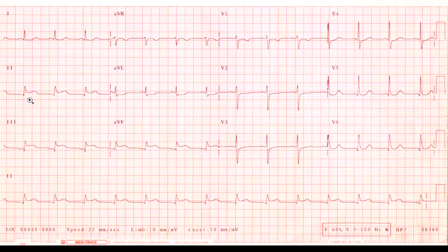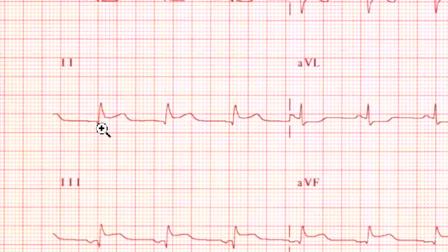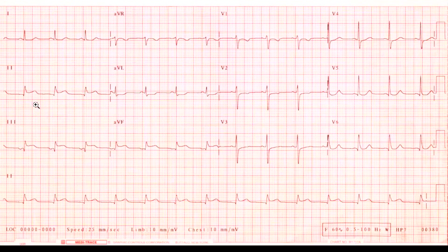What we're looking at here is a patient with an ongoing ST segment myocardial infarction. This patient is having a heart attack here as we speak on the ECG, and the way we can tell this is because right where this QRS complex is coming down, there's an elevation here in the baseline between that and where it started out between the P and the R. So this is higher than this, but it's even more than that — we're seeing it in contiguous leads.